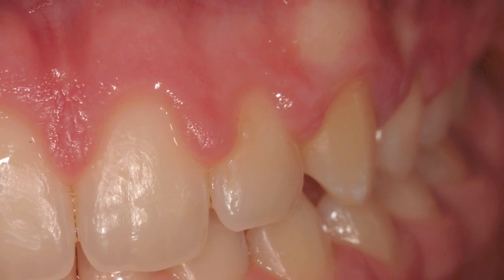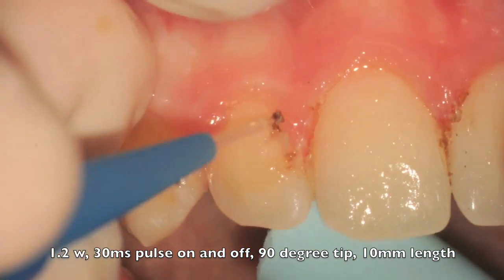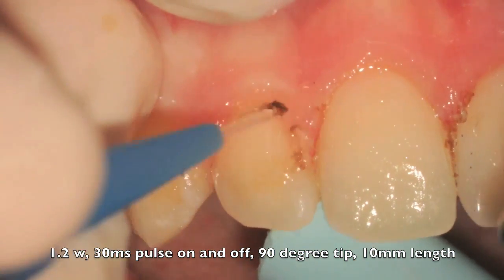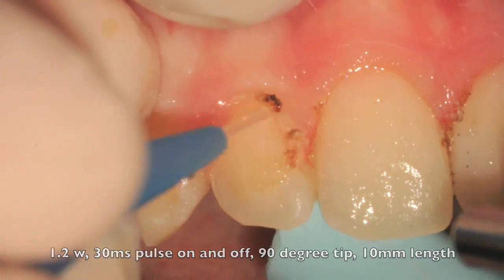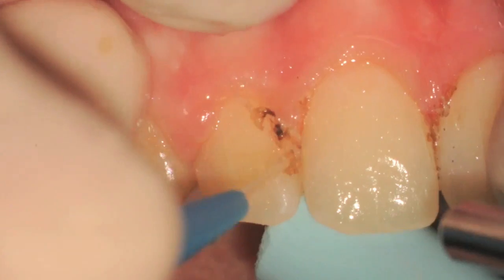The tissue is one week post-op. You can see here the straight tip that's been initiated being used at 1.2 watts in a pulsed mode, 30 microseconds pulse duration and 30 microseconds pulse interval.